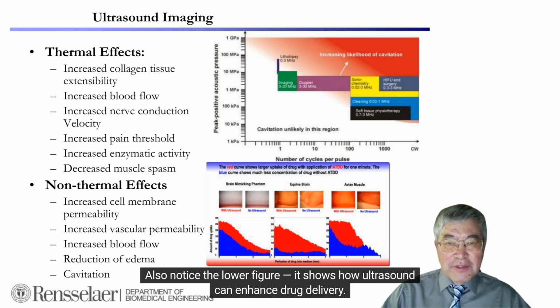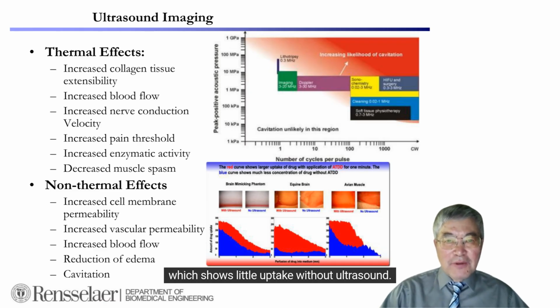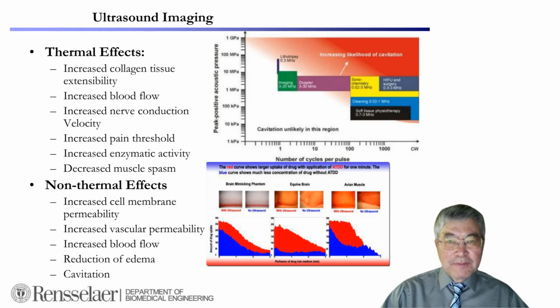Also notice the lower figure. It shows how ultrasound can enhance drug delivery. The red curve shows a larger uptake of drug when ultrasound is applied compared to the blue curve, which shows little uptake without ultrasound. This demonstrates how ultrasound can help drugs penetrate biological barriers more effectively.